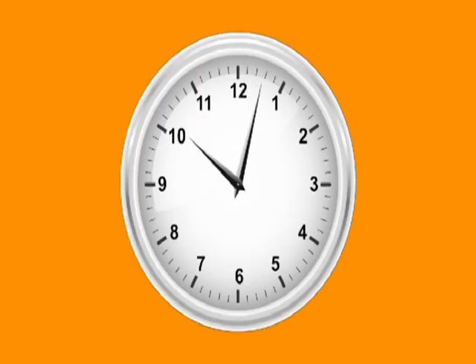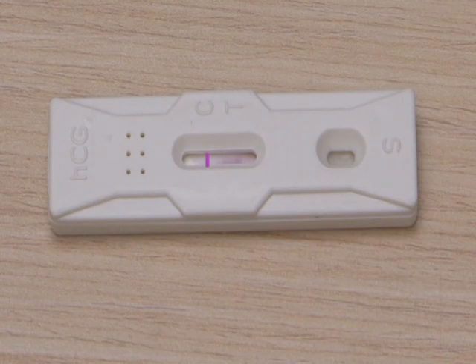Wait for 5 minutes. If one colored band appears in the result window R, the pregnancy test is negative. If 2 parallel colored bands appear, the pregnancy test is positive.